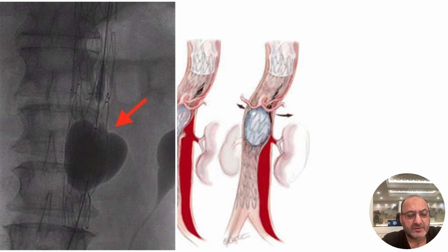We have done in our institution a lot of STABILISE cases. We routinely do them, but we are very, very careful. We never balloon more than the size of the native aorta. We use only non-compliant balloons, and when we balloon with the inflator, we are very, very careful. We go 2 atmospheres at a time, and we watch it very carefully. We have done a lot of these, 30 plus or more even. We never really had any rupture.